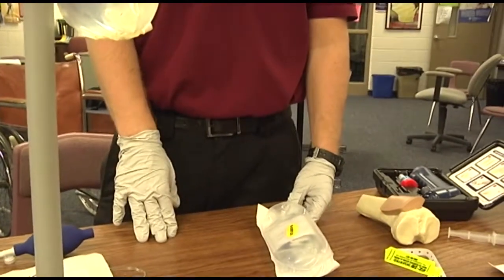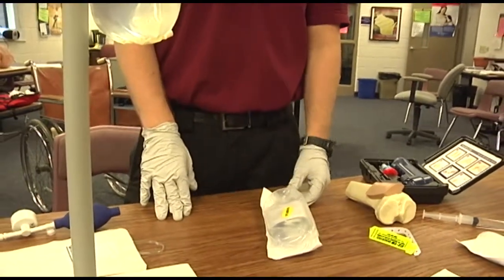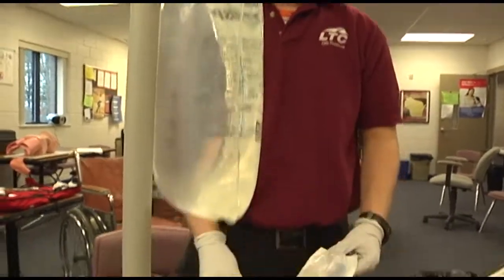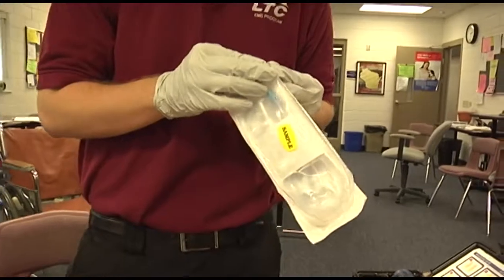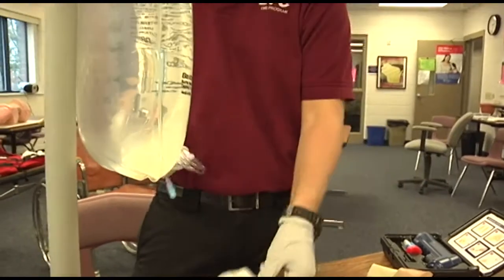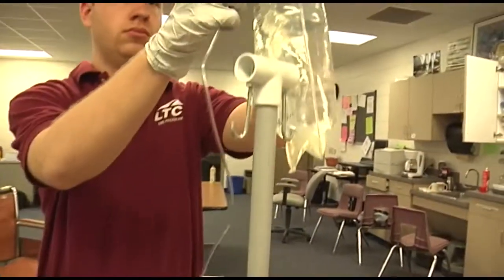Identifies the selected patient population, selects the proper administration set, connects the administration set to the bag, maintaining sterility of the ends.